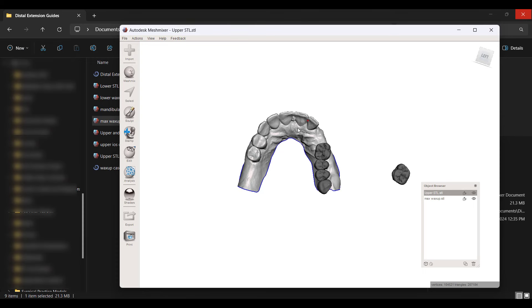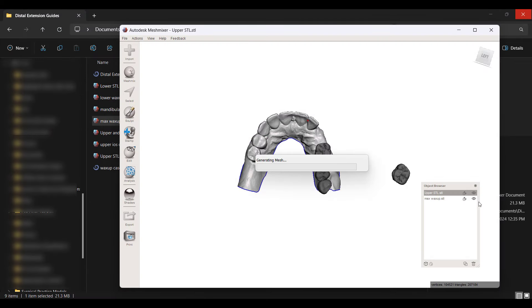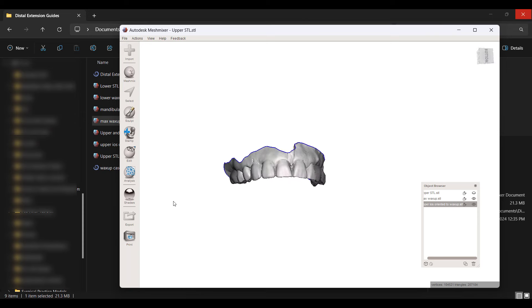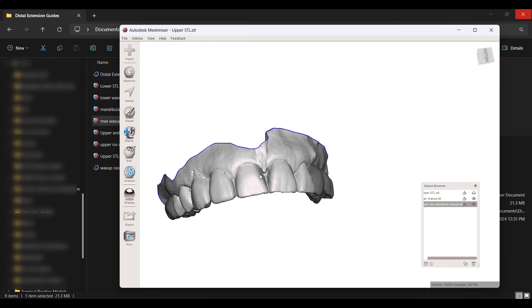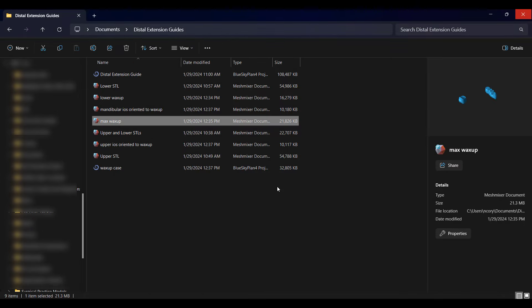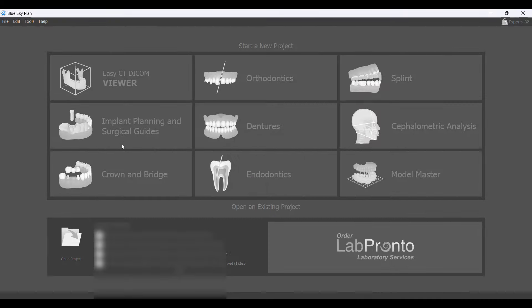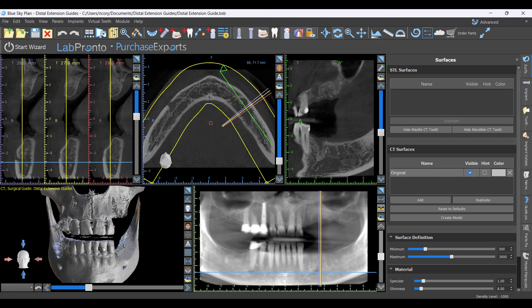Now there's my original intraoral scan. I import the maxillary intraoral scan oriented to the wax-up — and that's much better, because the STL saves its position in space too, so when it was modified in Blue Sky Plan it's now back in orientation with the wax-up. Finally, I go into the original distal extension guide case and reopen it, which is where we started this video with the models stitched to the CT.